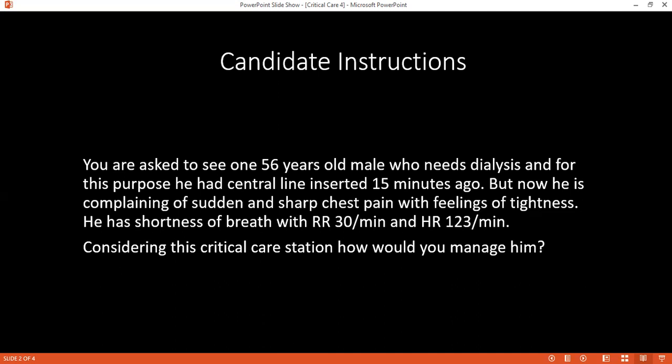Before then, I want to properly prepare the skin using an appropriate antiseptic solution. Then use an adequate sterile drape, and carry out the procedure using the NHS guideline. You can read those so that you can tell me very quickly.